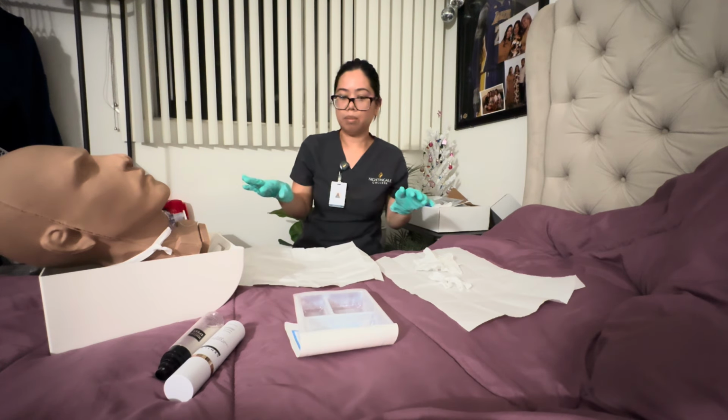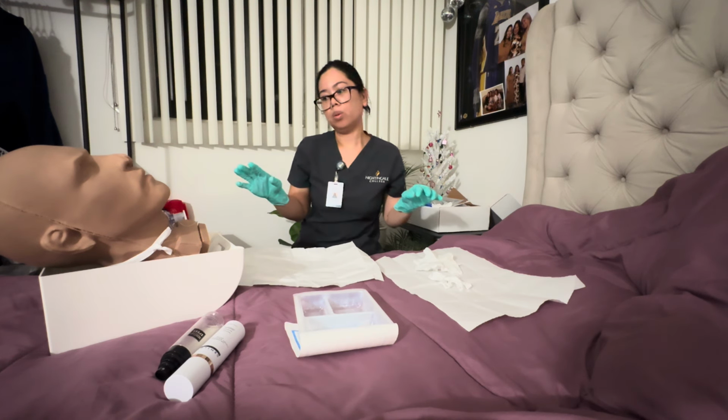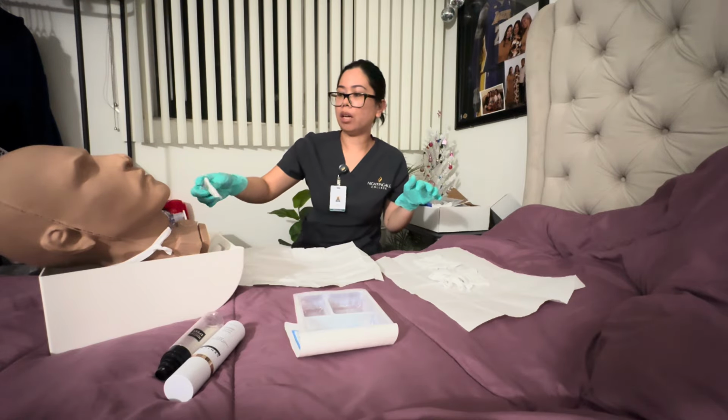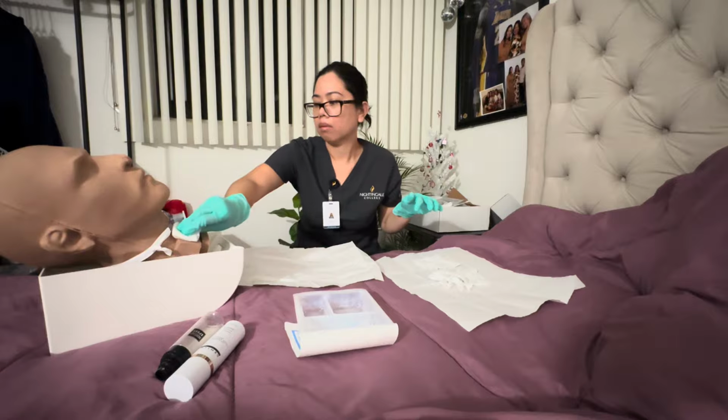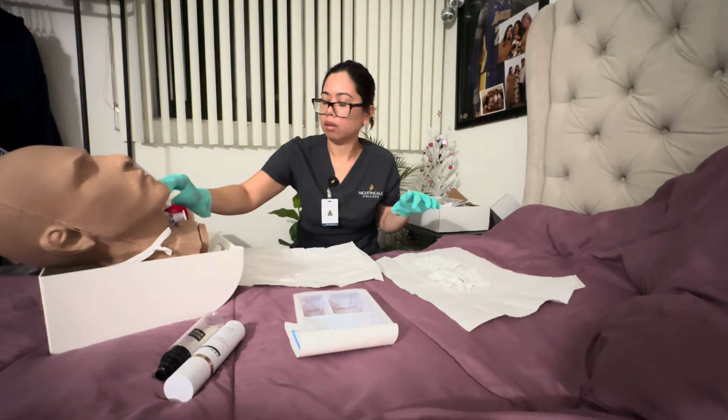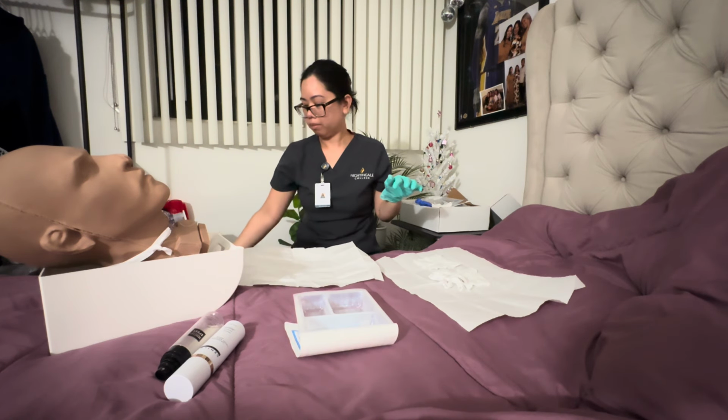Okay, now that it's all cleaned up, what you want to do is you want to pat dry the area. So how we're gonna do that is we're gonna use the 4x4 gauze, and we're gonna be patting dry the area and discard it.